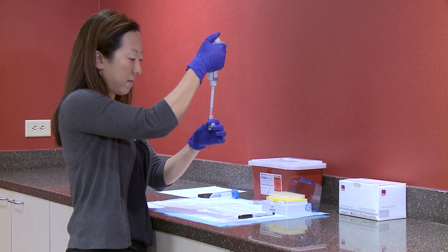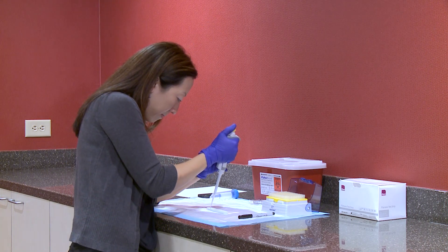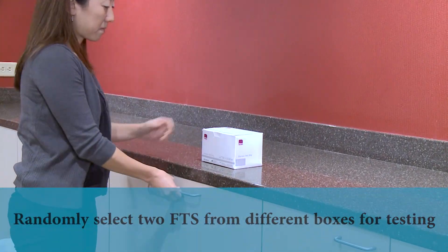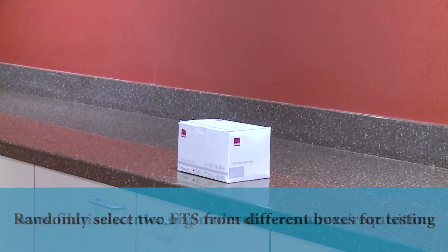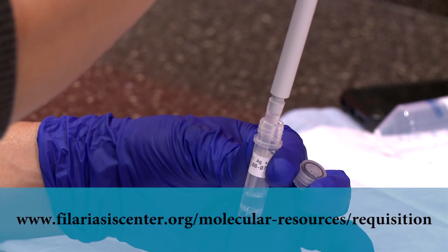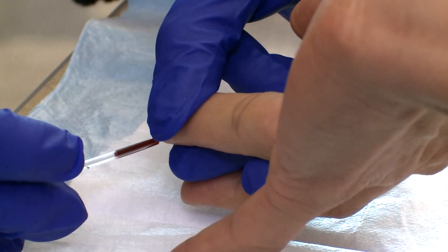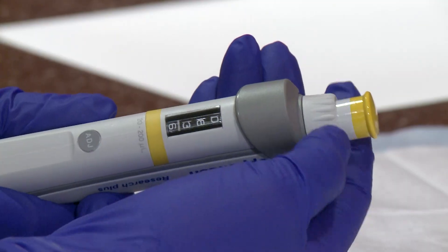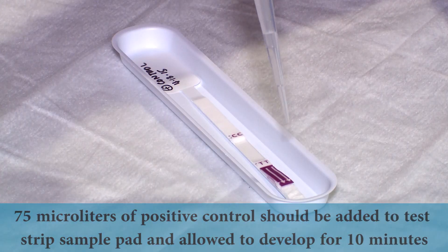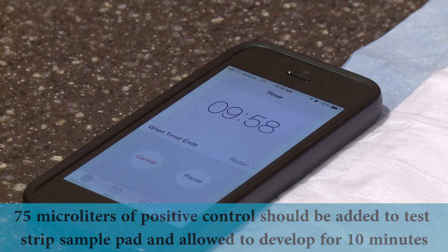Where available, a positive control should be used to assess two test strips from each lot of kits before beginning any field surveys. The test strips should be selected randomly from different boxes. Limited quantities of positive control can be obtained from the Filariasis Research Reagent Repository Center. The positive control should be used in the same way as a blood sample. If available, a calibrated pipette can be used to measure 75 µL of control. The control should be placed on the sample pad and allowed to develop for 10 minutes.